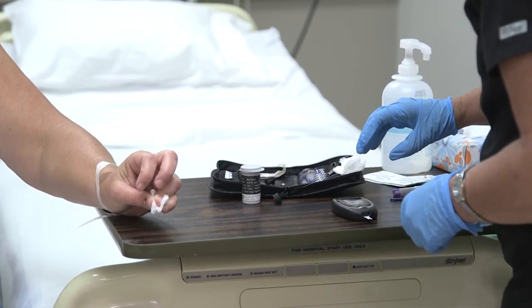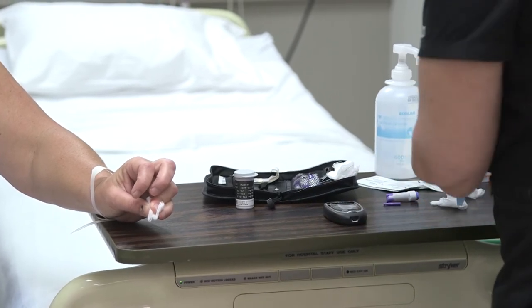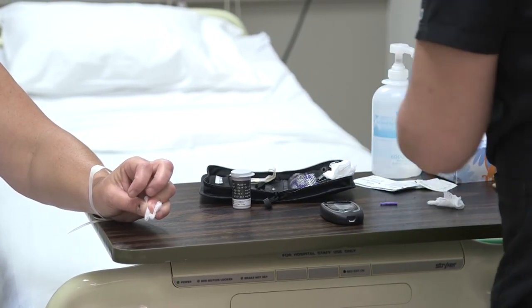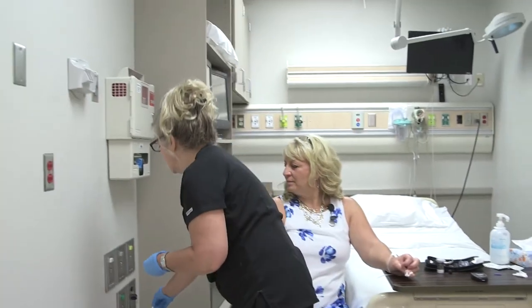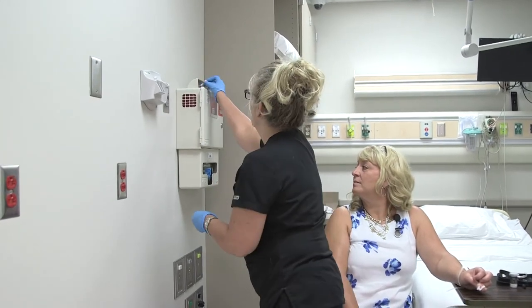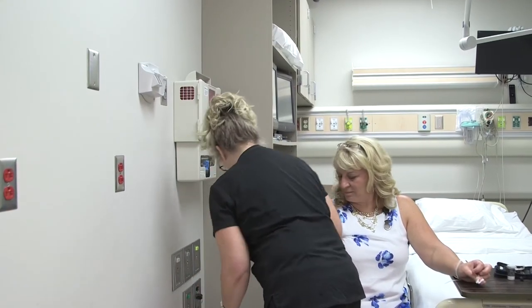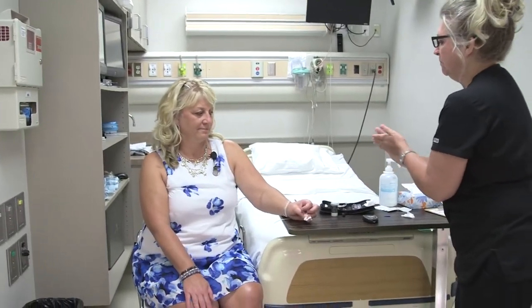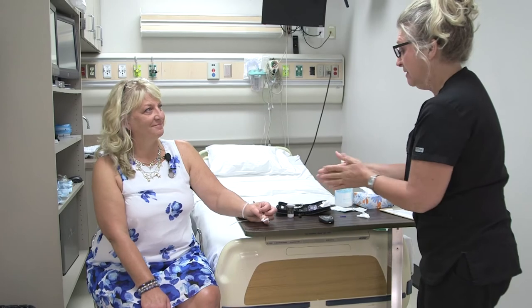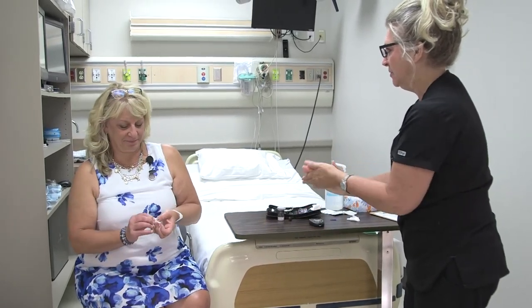Your blood sugar is very good — it's 103. So that's great, especially after eating. I'm going to dispose of the sharps in the container. It's only a small drop of blood, so I'm going to remove my gloves and do another round of hand hygiene.